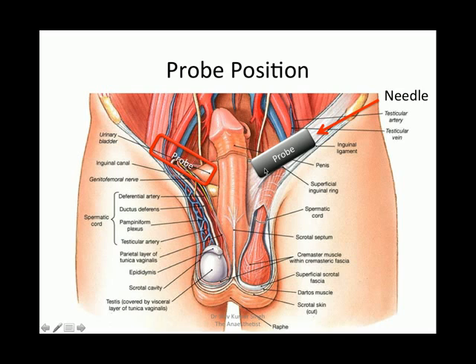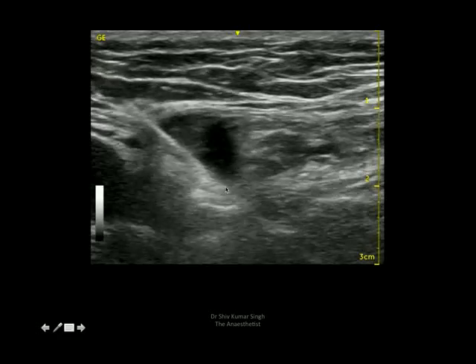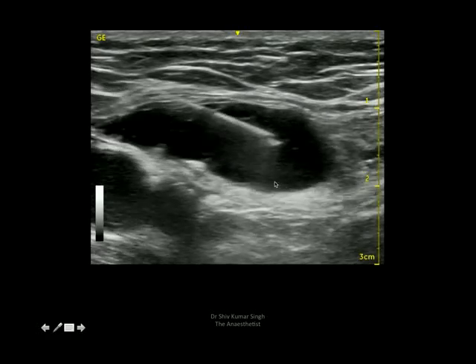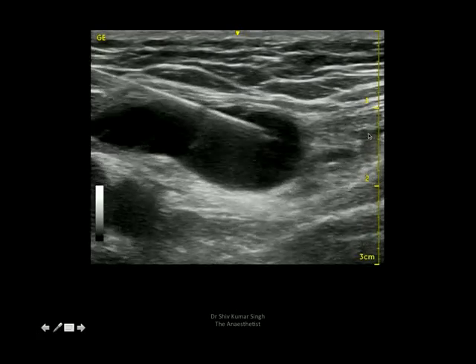The probe is positioned just above the inguinal ligament in an oblique direction, just lateral to the pubic tubercle. The needle is introduced from the lateral side in-plane. Here you can see the needle as it pierces the external oblique fascia, and we are depositing local anesthetic just lateral to the vas.